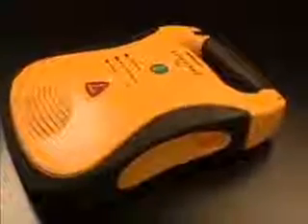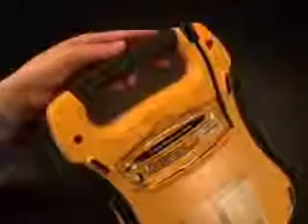The Lifeline AED should be kept with the battery pack inserted and the pads connected and stored in the pad holder. The unit should be kept in a readily accessible location with the active status indicator visible.